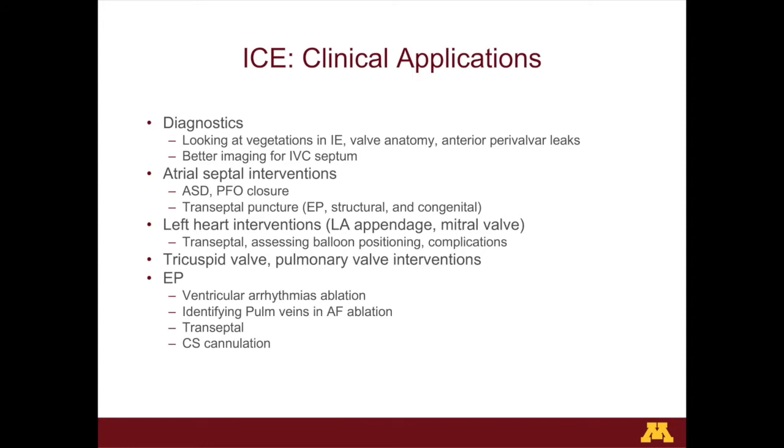In the interest of time, let me proceed with discussing the clinical applications right now before I spend a little bit of time on ASD-PFO closures. So in my mind, ICE is used either for interventions, which is the majority of the time, and sometimes even for diagnostic imaging. And I prefer to use ICE over TEE, especially when I'm trying to look for vegetations on pulmonary valve, especially if they are inside a bioprosthetic valve or a stented valve, where TEE may not be very useful. ICE is very useful in separating out clot versus vegetation.